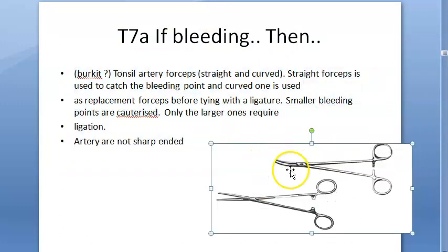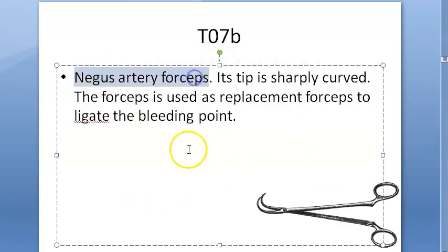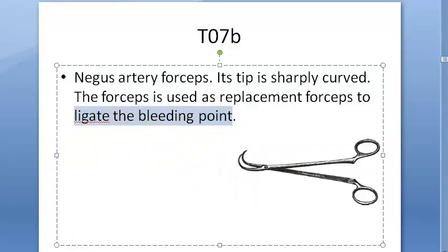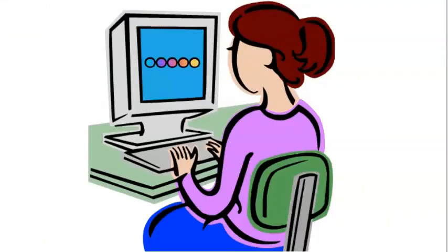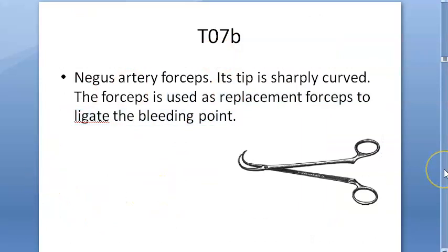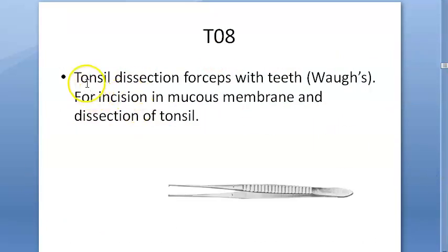You have the straight forceps and slightly curved ones. Then you have the Negus artery forceps, which is curved. This is used to ligate the bleeding point. We are looking at tonsillectomy instruments — the Negus artery forceps.